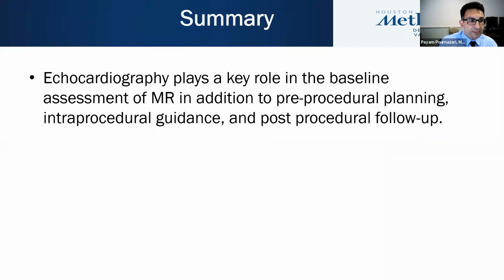In summary, echocardiography plays a key role in baseline assessment of mitral regurgitation in addition to pre-procedural planning, intra-procedural guidance, and post-procedural follow-up.